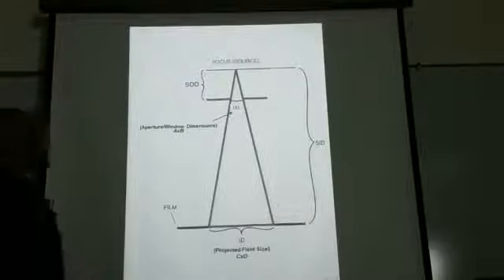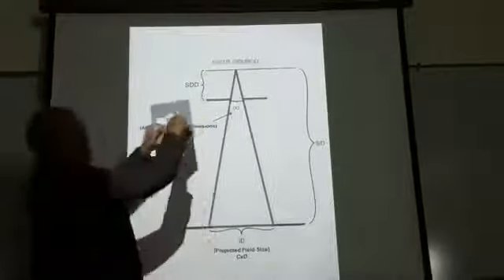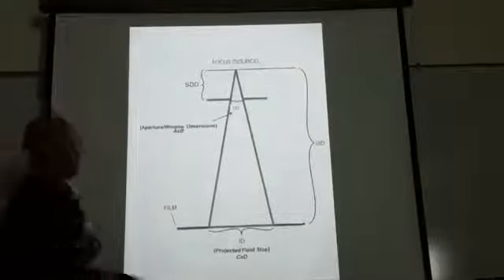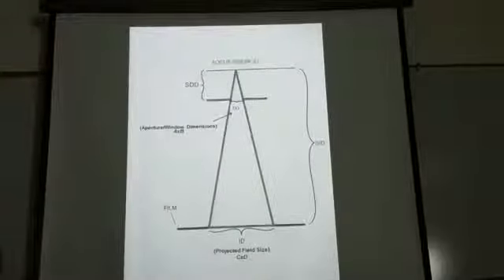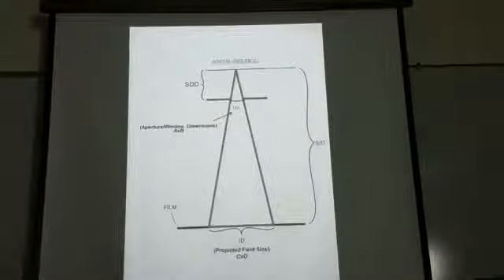Okay. Now here is your X-ray beam being projected through your aperture window, the aperture diaphragm, as it's being reflected down. ID stands for image dimension, or let's just call it your beam dimension, your X-ray beam dimension. That'll help. ID stands for image dimension or beam dimensions.